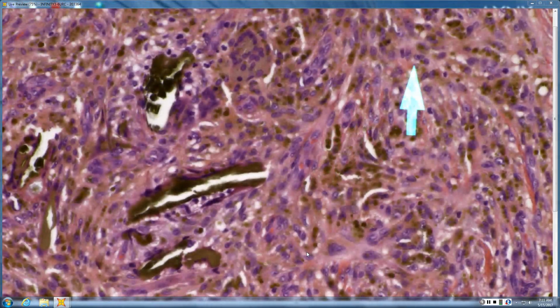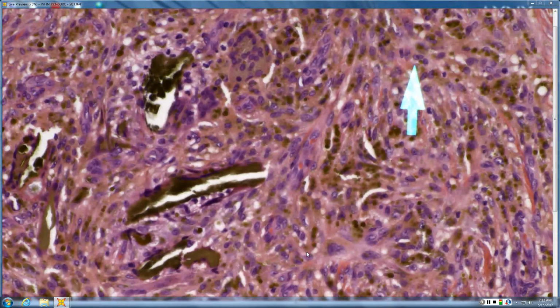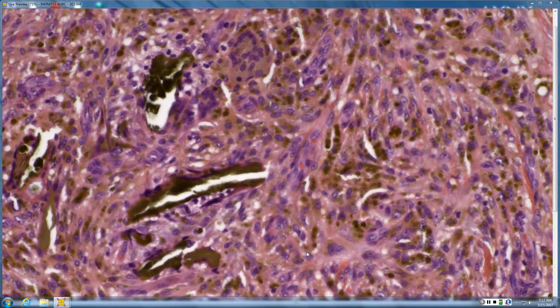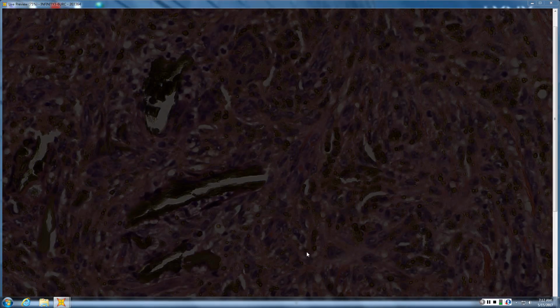So they don't really look like classic blue nevus cells, though. These are probably still just all histiocytes, and it's more of a granulomatous response. But there's even some fine stuff in here that almost looks like melanin. But it's not melanin, and certainly the majority of this is absolutely not melanin, because it's these larger yellow-brown globules that are somewhat refractile. See here, you put the condenser down, and melanin is not that way.